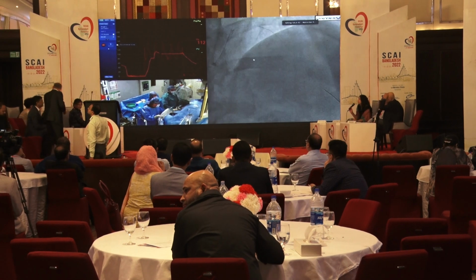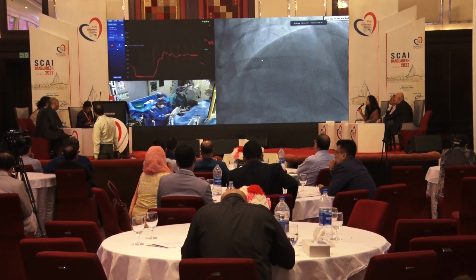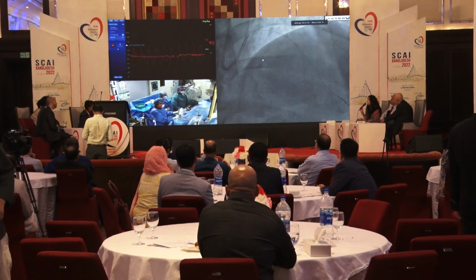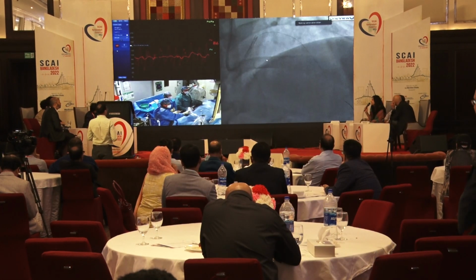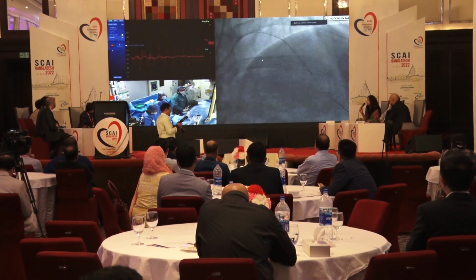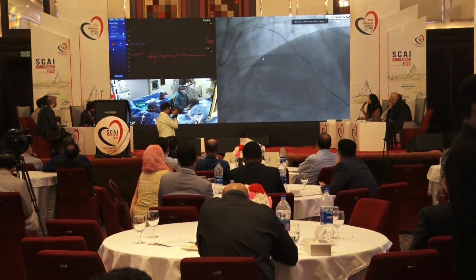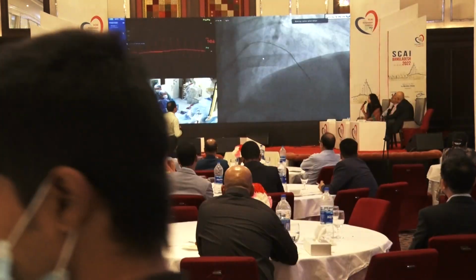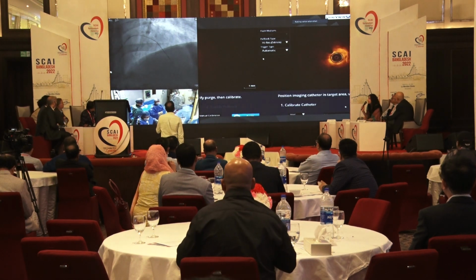We are not dealing with a diabetic patient with a very high symptom score, so I think it's very acceptable to do. I think this is where your plan of doing iFR with pullback to assess whether or not there's a clear step up versus a gradual increase throughout the vessel will help you differentiate whether bypass or PCI would be a better option. So if you see a clear step up, which you did across the lesion, PCI is appropriate. And if you're seeing a gradual normalization all the way back to the proximal segment, you're not going to stent the entire LAD, maybe bypass would be better at that point.